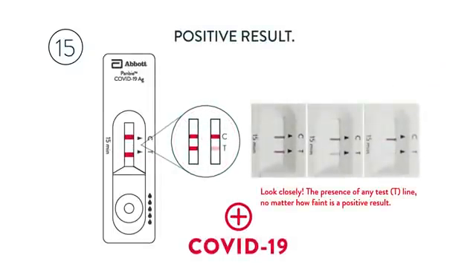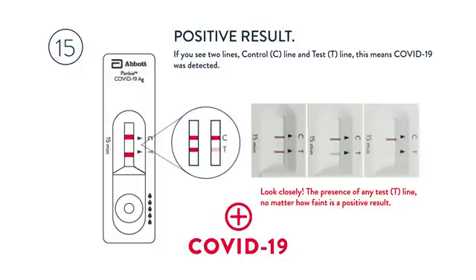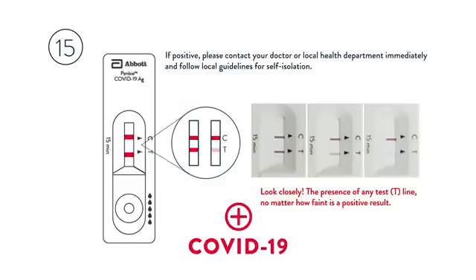Positive result: if you see two lines — the CTRL-C line and the test T line — this means COVID-19 was detected. The presence of any test T line, no matter how faint, is a positive result. If positive, please contact your doctor or local health department immediately and follow local guidelines for self-isolation.